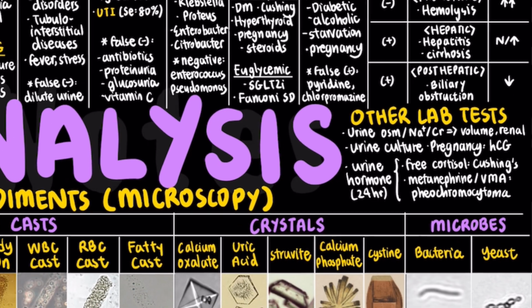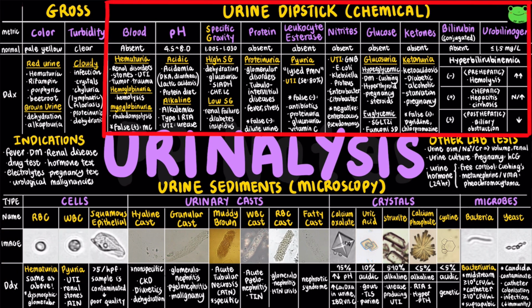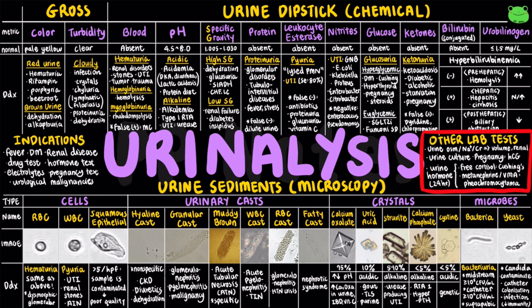And that wraps up our overview on urinalysis, from the gross examination to the urine dipstick, microscopic sediments, and other lab tests.